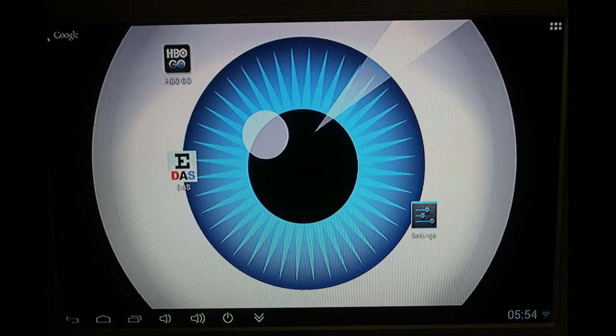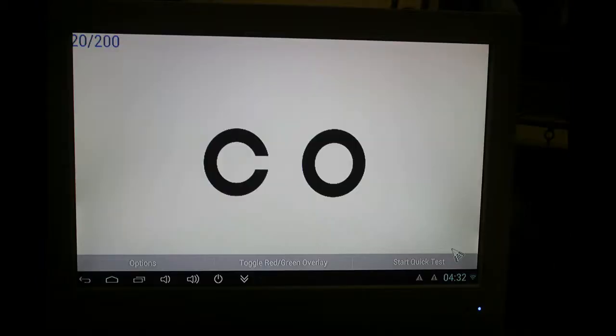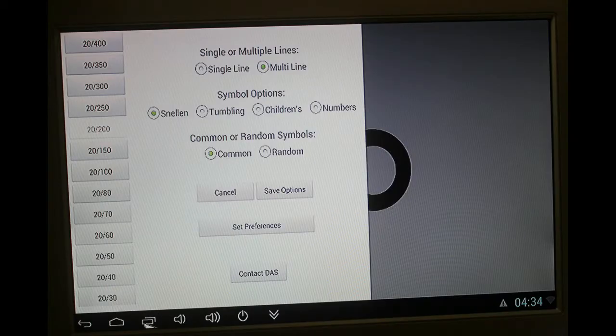Once you power up the monitor, the eyeball screen will appear. Please click on the EDAS icon to launch the program. Once you launch the program, you'll see an Options button in the lower left-hand corner. Please click on that to get the setup. When this screen comes up, please click on Set Preferences.